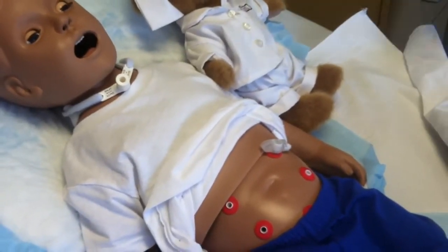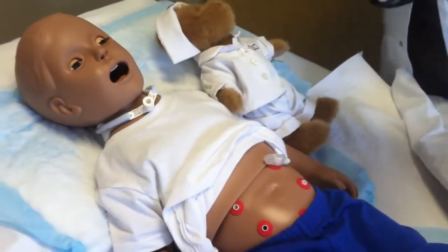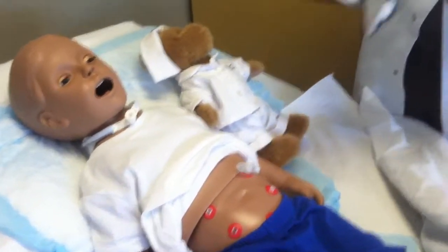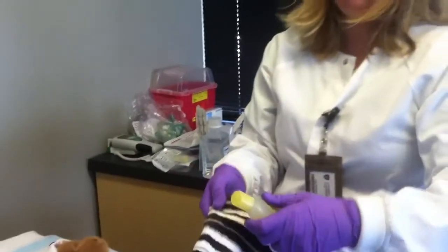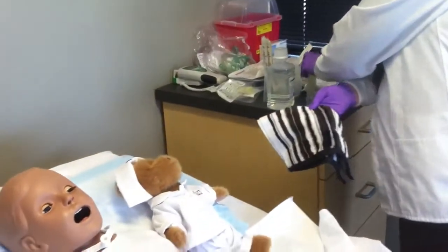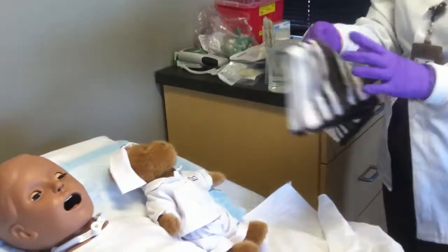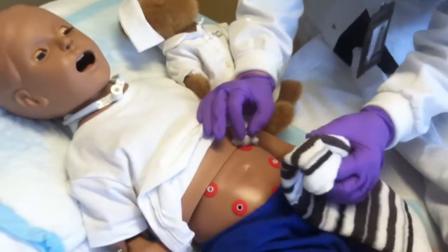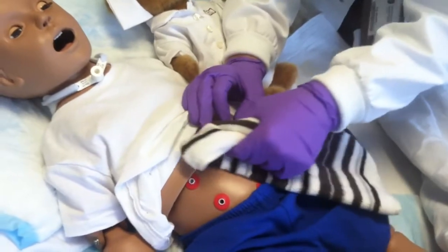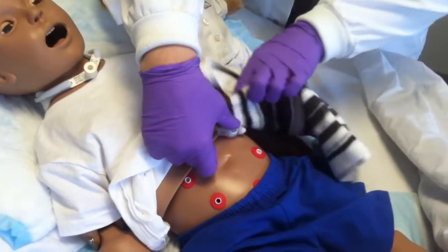Okay, so let's say this is a well-healed G-tube site, then we can just use the soapy water on a washcloth. What I would do is on one part of the washcloth, have a little bit of soap on it, just like 1 drop. And then the other side is still wet, and you can use one side to wash and one side to dry. So I would gently tilt up the Mickey, and I would start washing. And then on the other side, tilt up, tilt down and wash.